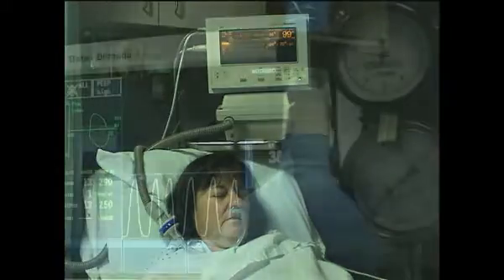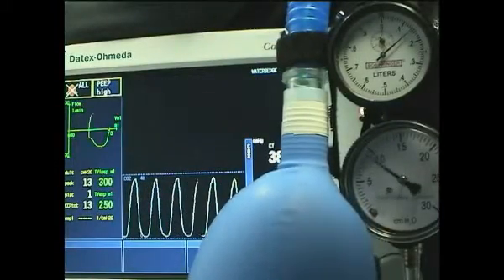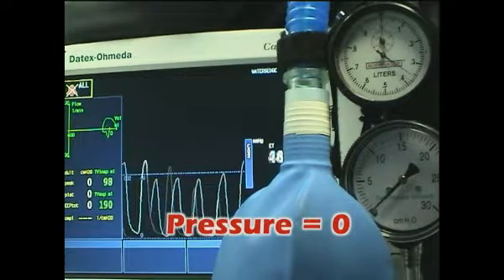In conclusion, an added degree of vigilance is required to use nasal CPAP in anesthesia practice. Nevertheless, the experienced anesthesiologist will find an area of his practice where nasal CPAP is a worthwhile alternative approach to airway management.